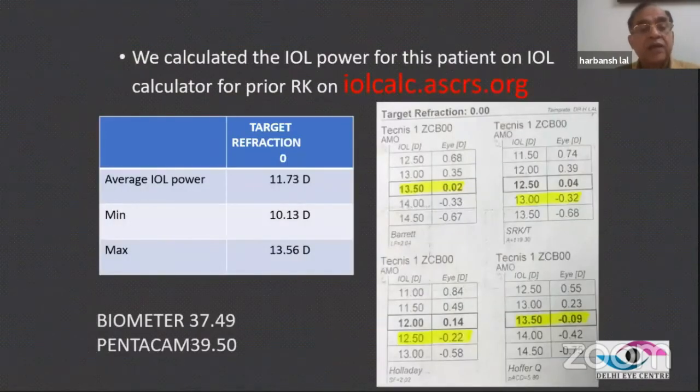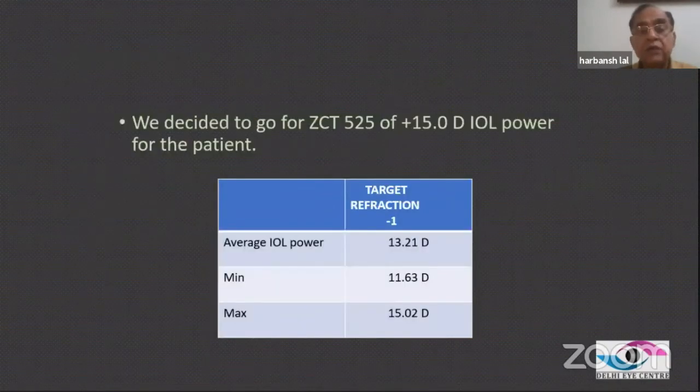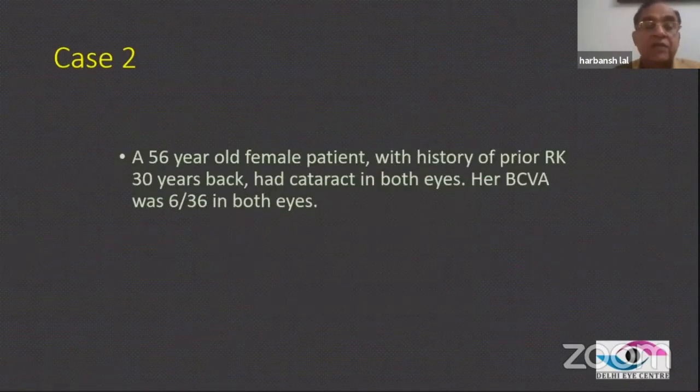So once we did the target refraction zero, the maximum we got was 13.56, which was matching with the optical biometer, because the optical biometer was flatter than the Pentacam. And I always target minus one. In this case, so far as the cylinder was concerned, there was a very good agreement on the refraction, which was minus 3.5 at 80 degrees. Lenstar reading was 75, axis on Pentacam was 82, so an excellent agreement. So we can go for the toric IOL correction. So we use the ZCT 525, which will give 3.5 correction with the 15 diopter of IOL instead of 13.5, because we targeted for minus one refraction, which gave us an excellent result. So I always target minus one at least.